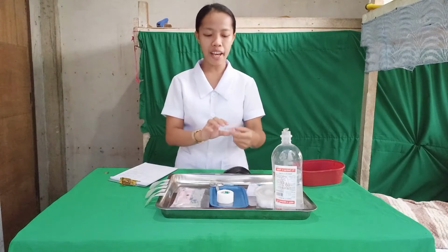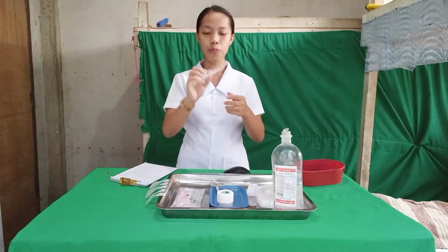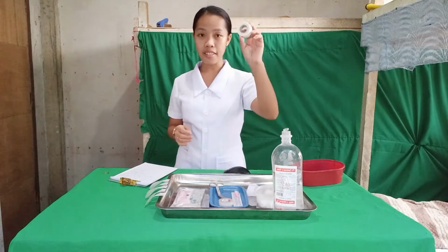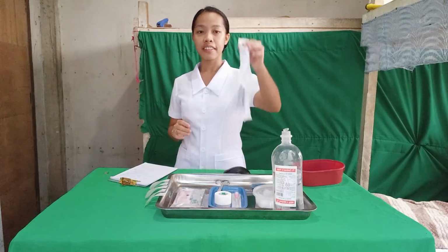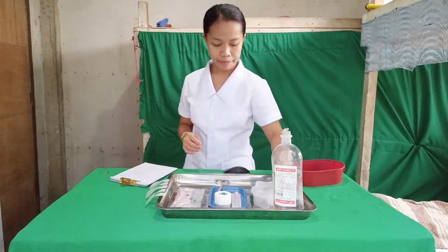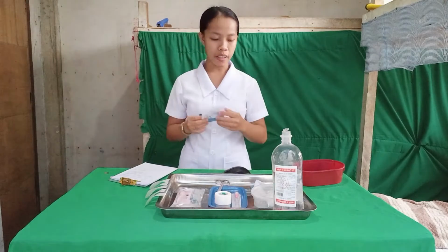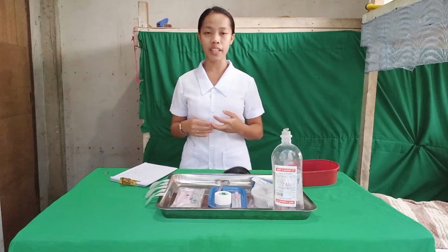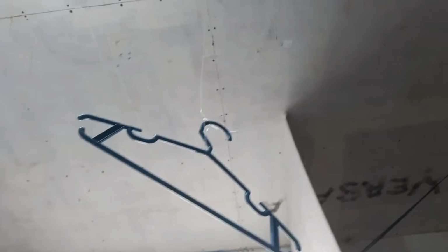Next is the IV cannula. The IV cannula has a pink valve, which means it is gauge 20. Then the plasters, the scissors, an improvised tourniquet, the cotton ball soaked in alcohol, medication ticket, and the IV label, and also a kidney basin. Supposedly we should have an IV pole, but since we lack resources, I will just have an improvised IV pole or IV stand.